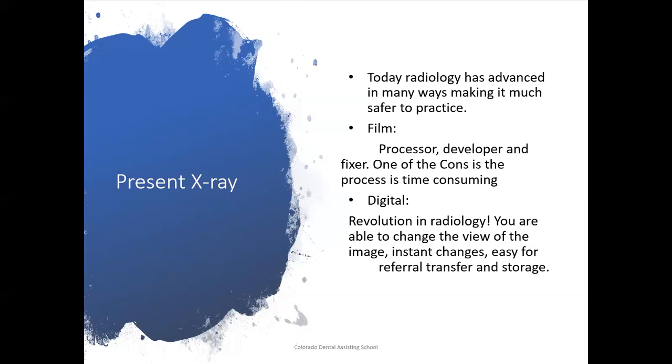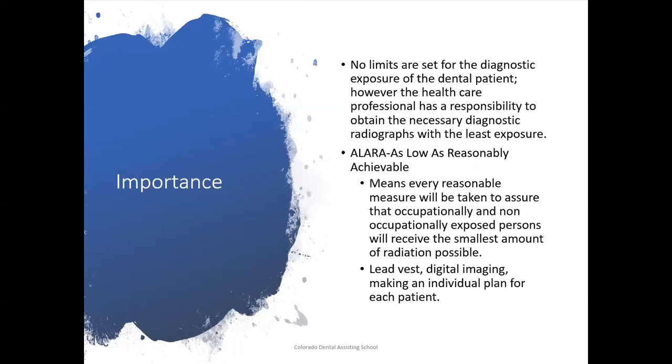We can email it to someone safely in a locked email that's password protected, or we can see it immediately on the screen as we take x-rays. So it has a lot less radiation involved because it doesn't need to be exposed as long as the film did under radiation to capture that image. It's pretty amazing. There are no limits that are set for any diagnostic exposure from the American Dental Association.